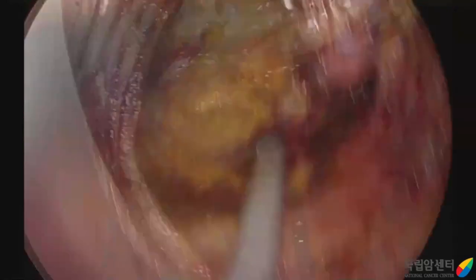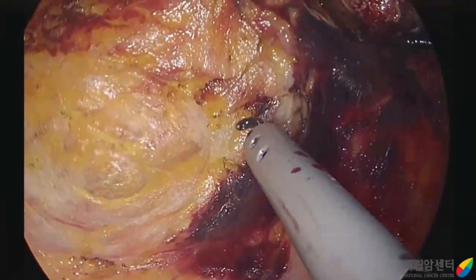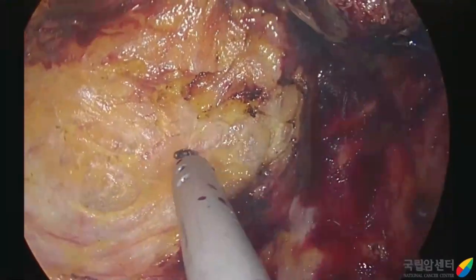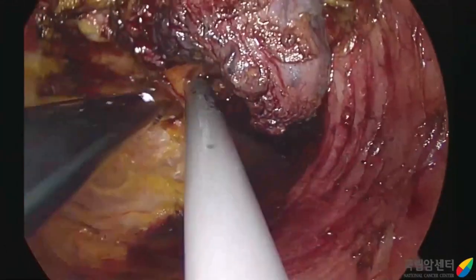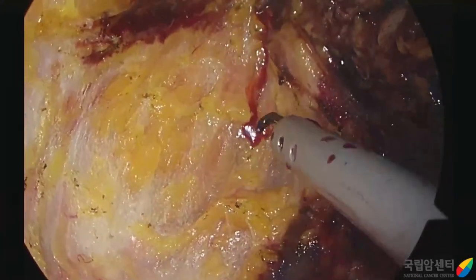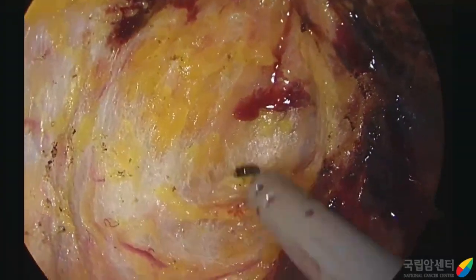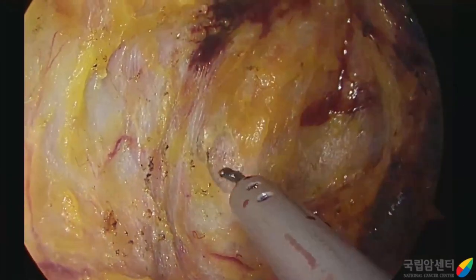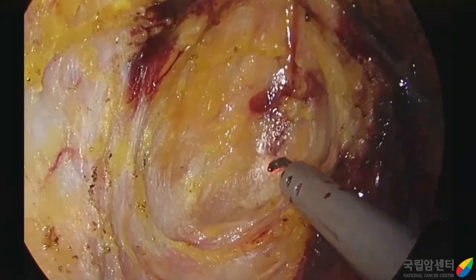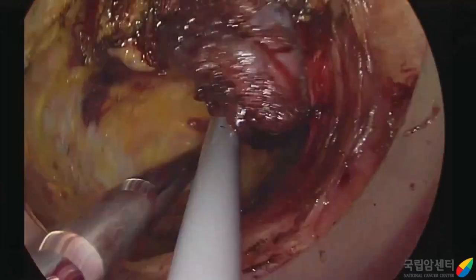We can clearly identify the sacral nerve fibers because transanal TME provides very good visualization of pelvic anatomy. We should be careful not to go into the wrong plane. During transanal dissection, the presacral venous plexus is very easy to be injured. So it is important to proceed slowly, making sure that the vessel is not exposed.